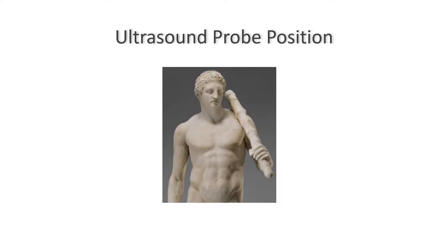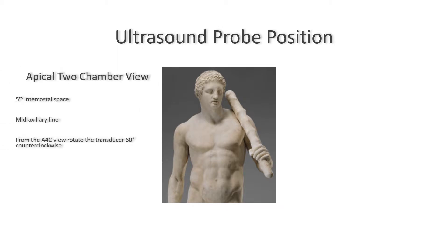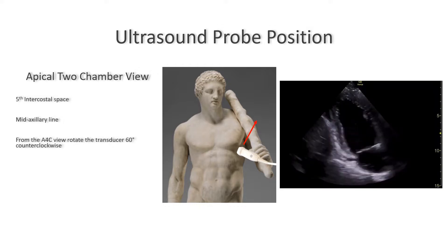Let's talk about the ultrasound probe position. The apical two chamber view is actually pretty straightforward to acquire once you have the apical four chamber view. From the four chamber view you just need to rotate approximately 60 degrees counterclockwise to demonstrate the apical two chamber view, and you should be getting an image with only the left side of the heart visible.